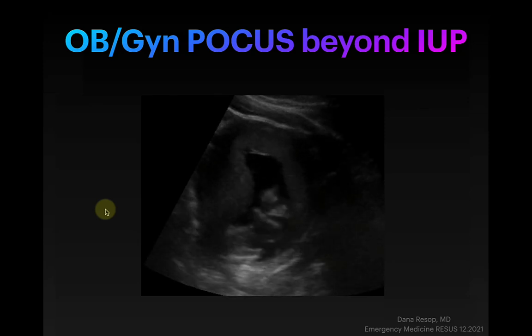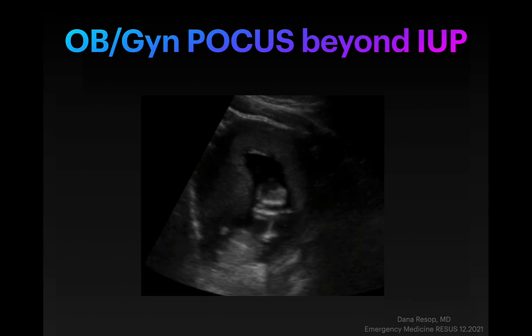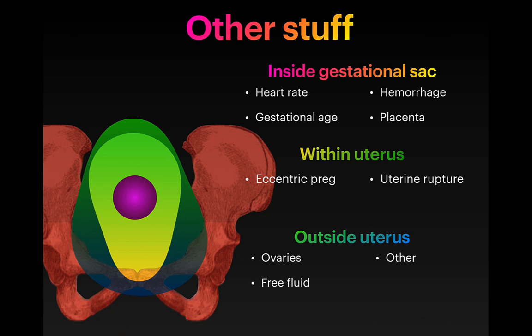All right, so after Dr. Schmidt's excellent lecture, we're going to go on to talk about a little bit more of other things that are in the pelvis. So point of care ultrasound beyond just the IUP. I'm going to structure today's lecture by going from the inside to the outside.